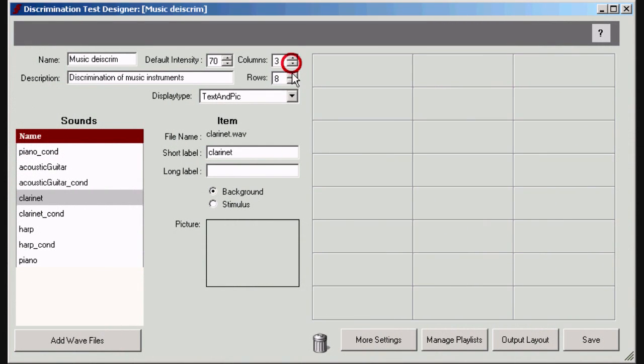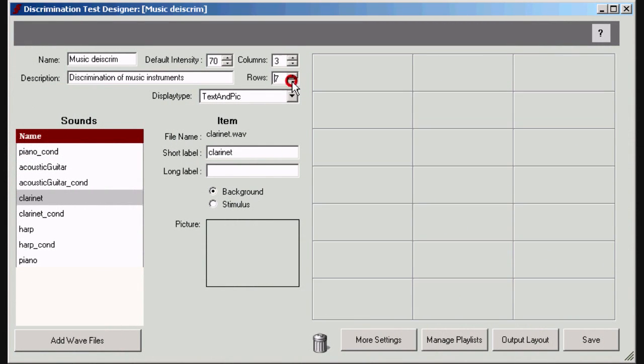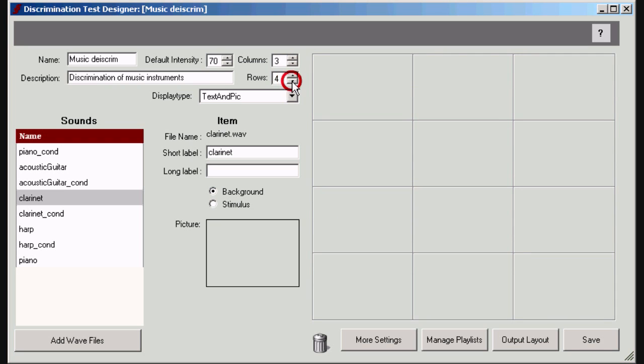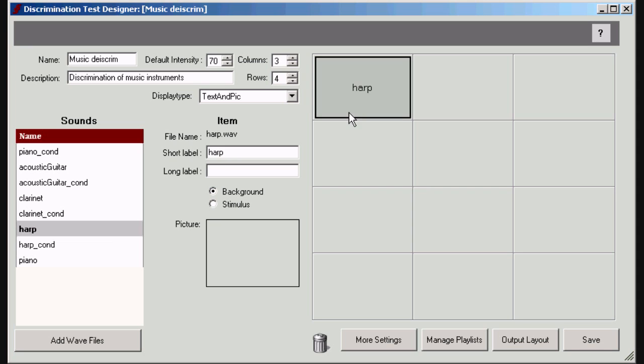Decide how many rows and columns you need to display the items in the final test screen. Drag and drop each WAV file to its desired position on the screen.